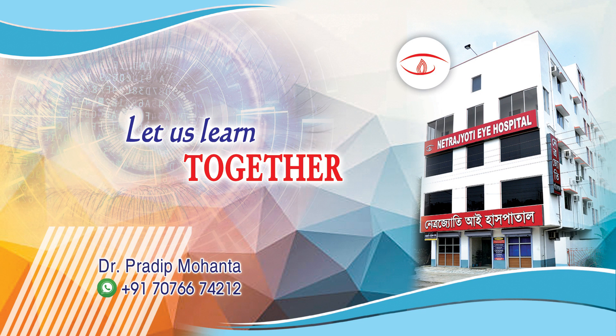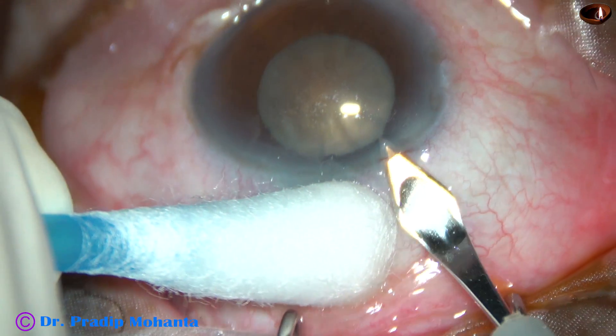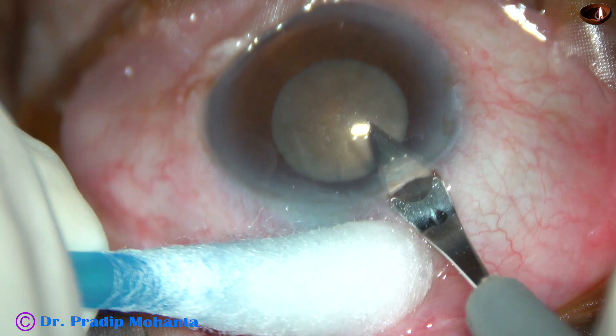Friends, welcome to my workplace at Ranagh Hart, West Bengal, India. Let us observe phacoemulsification of this very hard cataract.